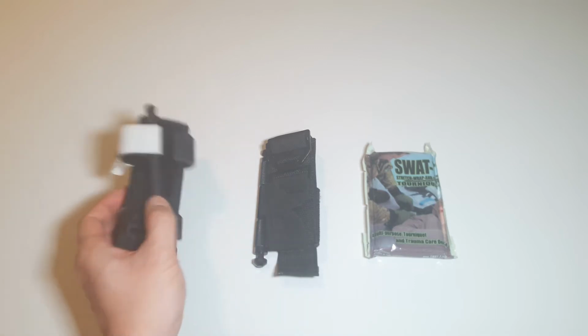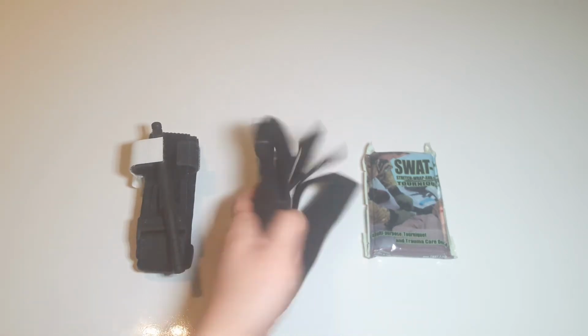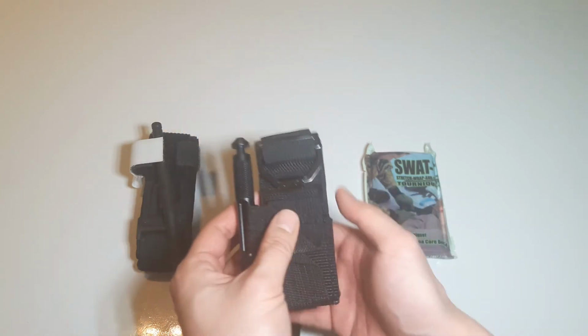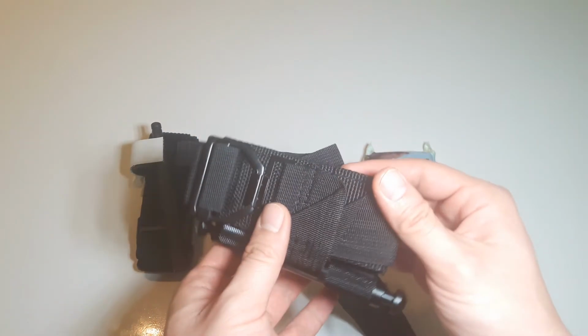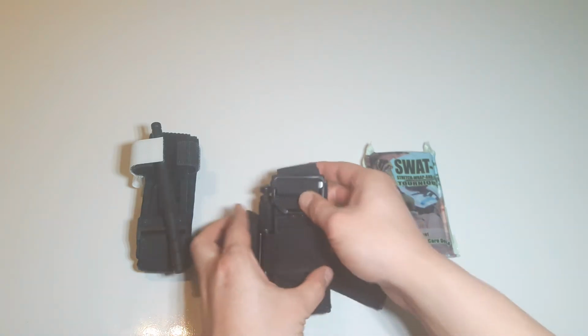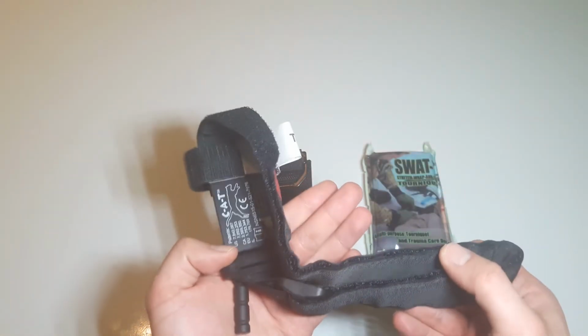If durability and reliability is most important to you, I would go for the SOF-T Wide, which is my personal preference. It's more durable and reliable because it uses metal parts in critical areas, whereas the CAT uses all plastic. The only plastic part in the SOF-T is this piece right here that holds the windlass. I have heard of the plastic windlass and buckles breaking on CAT tourniquets by other reviewers, but I can't be sure if they were using it properly or a fake one.